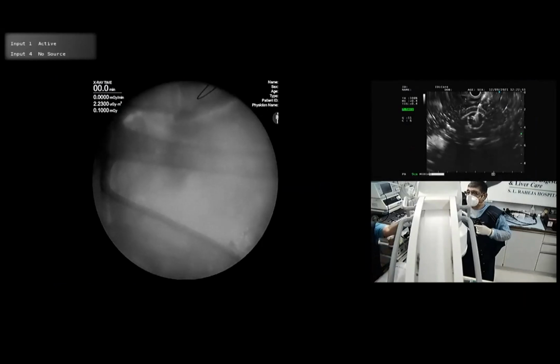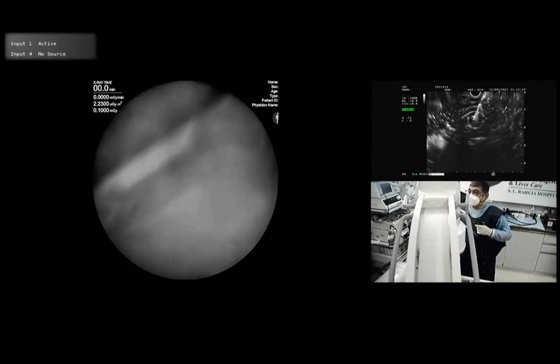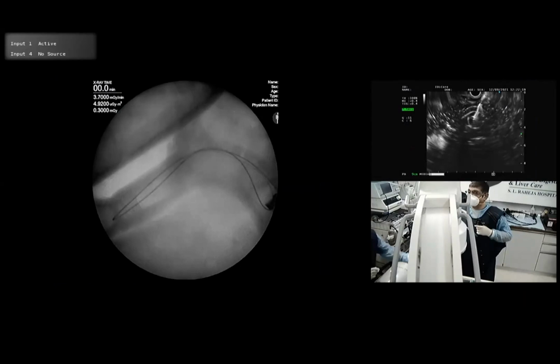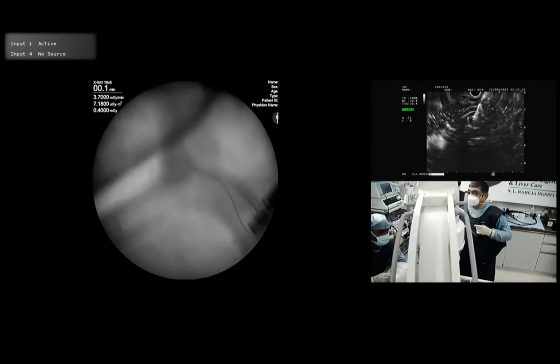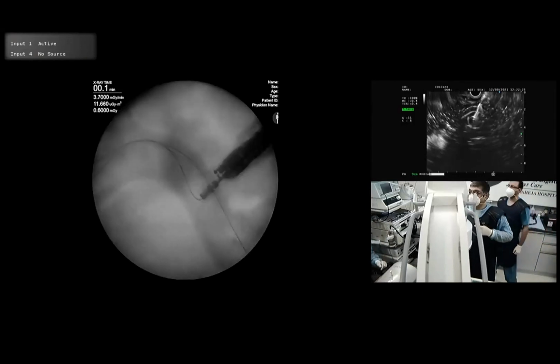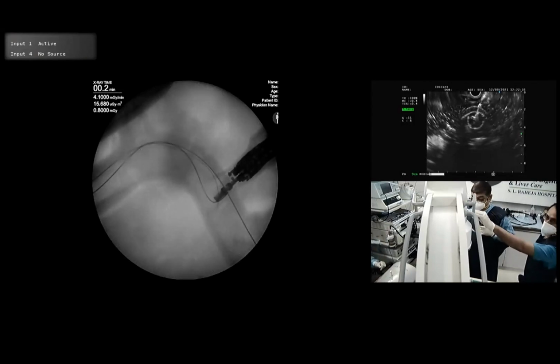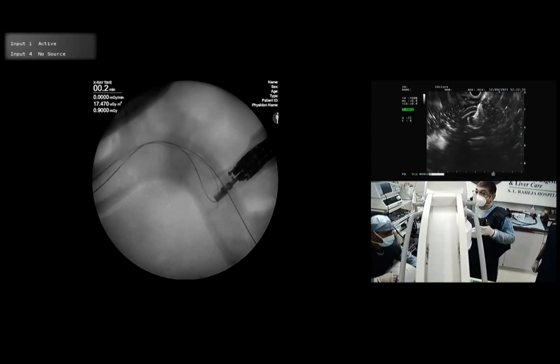Stop. So you can see the pancreatic duct below. Yes, show. You see what is happening to the wire now? See this. We are in the bile duct and the wire is coiled 1,000 times inside. Yeah. So it's an irretrievable situation. Hold it. So fluoro helps.